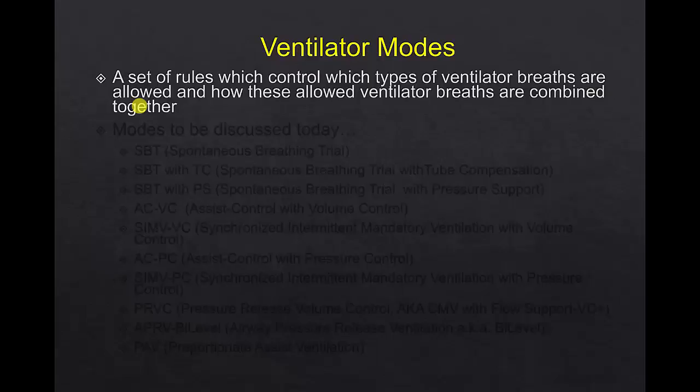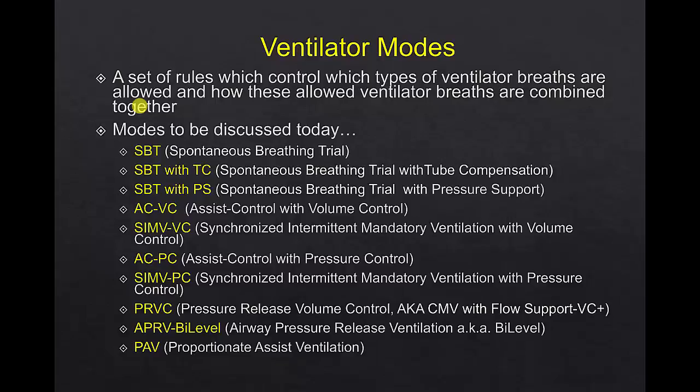Before we get started, let's define what we mean by ventilator modes. A ventilator mode is a set of rules which controls which types of ventilator breaths are delivered and how these ventilator breaths are combined together. Today, I'll discuss several ventilator modes, and although this list looks long and daunting, there are actually even more than this. I'll define these as I go along.